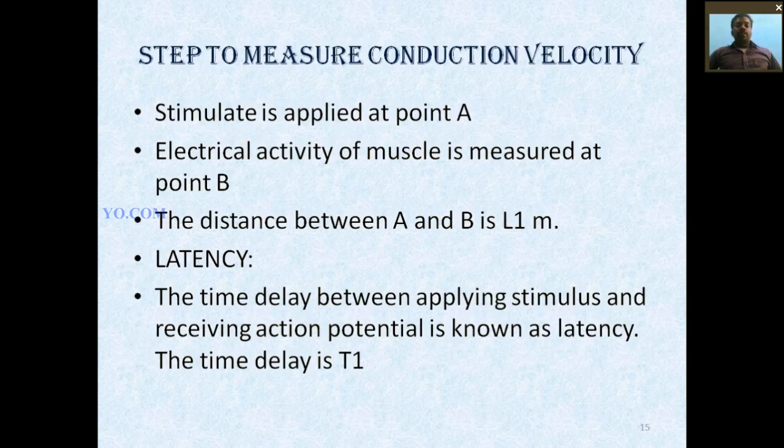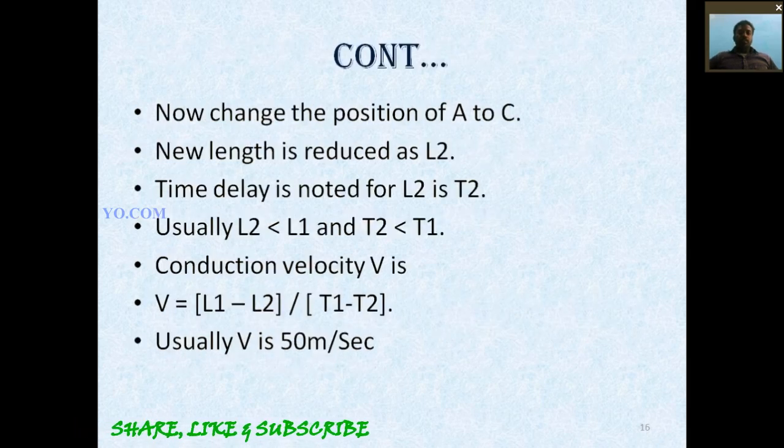The time delay between applying a stimulus and receiving the action potential is known as latency. The time delay is T1. We apply the stimulus, then how long after applying the stimulus the action potential is received, that is called T1. Similarly, T2 is also measured.